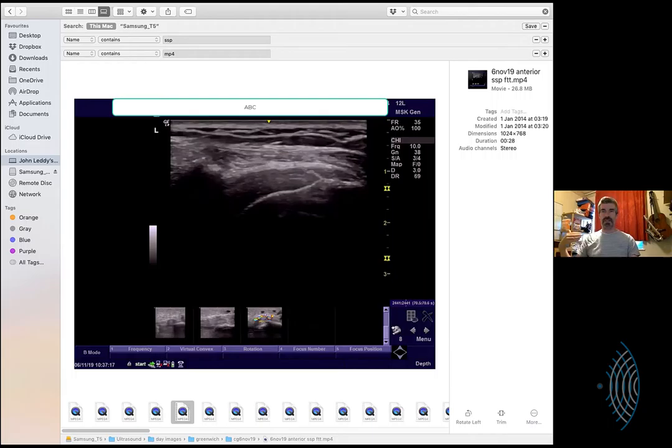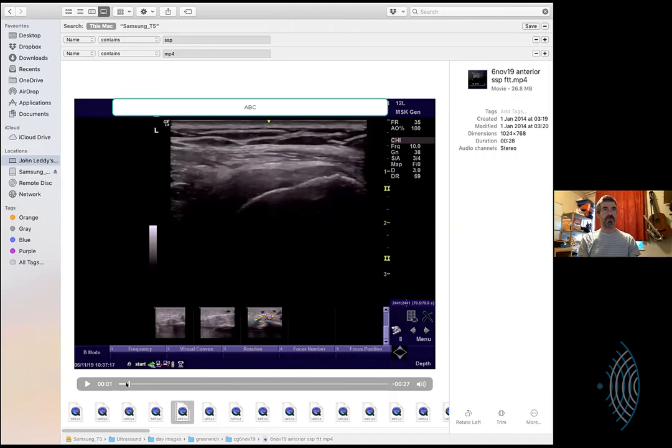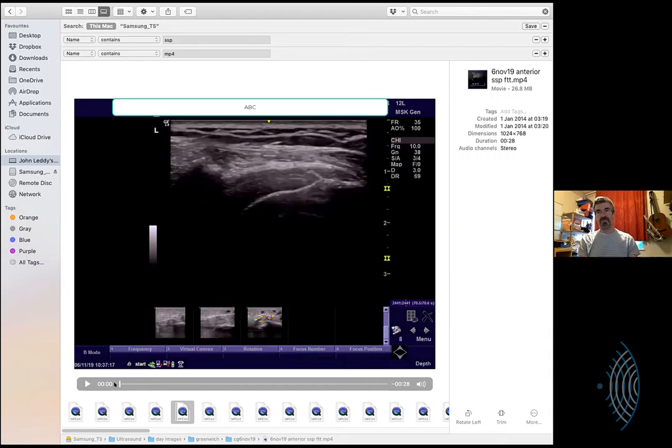No, I'm much more interested in the bone. Just from the shape of the bone here, yes, I think we're starting long section somewhat posterior. So I think of it, the biceps is the anterior margin. Yes, and so anterior to posterior is the way I think of it. This is the anatomical neck. Yes. Subtle thing here. This shape can be due to the fact that you are posterior, or it can be due to wear and tear, just degenerative change in the greater tuberosity. But posterior meaning that you're dropping off the superior facet, going to the middle facet, or your classic supraspinatus to infraspinatus insertion.